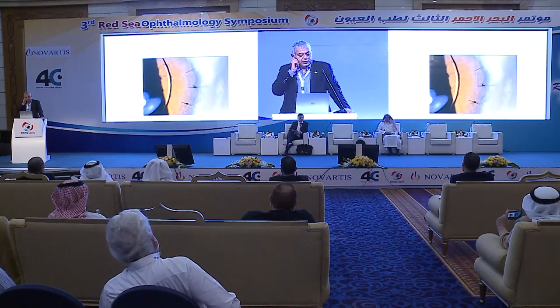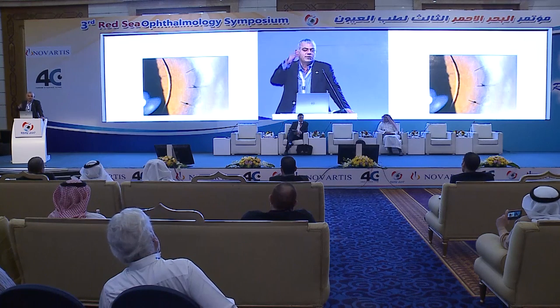Now, fast recovery. I think the PMMA lenses with a large incision, 6 millimeter or 5 millimeter incision with sutures, they were excellent lenses for the 90s. But today, I don't think they have a place in refractive surgery. And remember that if you put this lens today, they will be removed 30 years later. The next generation of ophthalmologists will not know how to do a 6 millimeter incision or how to close it and how to do suturing for such large incisions. So I think today the place is only for foldable lenses. And as I mentioned at the beginning, the majority of these lenses will be removed. So removal is very important.